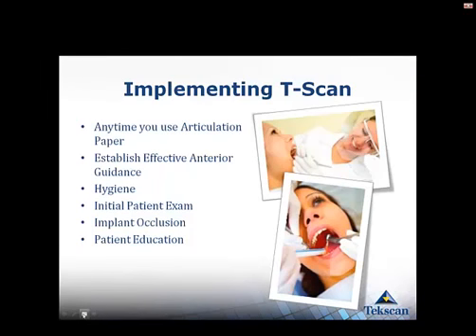And so what are some of the ways that you can implement TScan into your practice? With this, what I really recommend you doing is speaking with your TScan rep on a one-on-one level. Everybody has different practice, and we have some doctors that use TScan every time they use articulating paper. They use it on all their hygiene patients and all their initial exams. And then we have doctors that only use it for larger cosmetic cases. So I would really highly recommend just speaking with your TScan rep and looking into your practice and deciding what patients you are going to use it on and where it's the best fit.